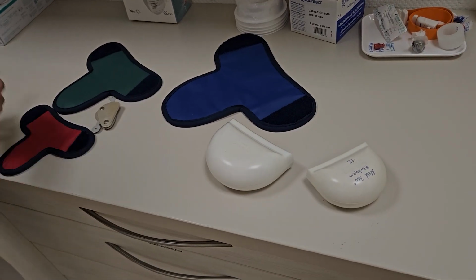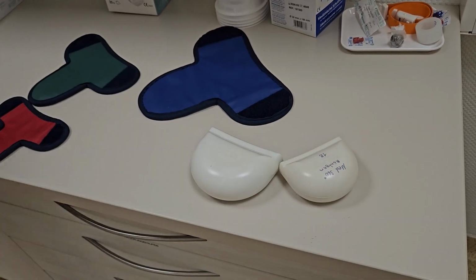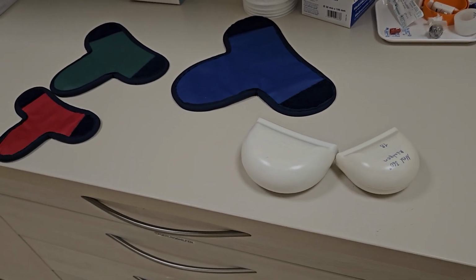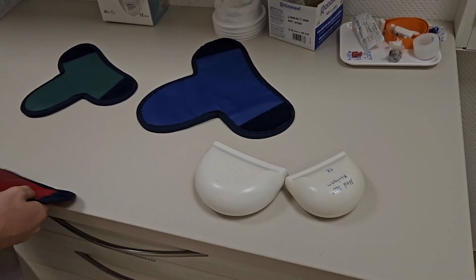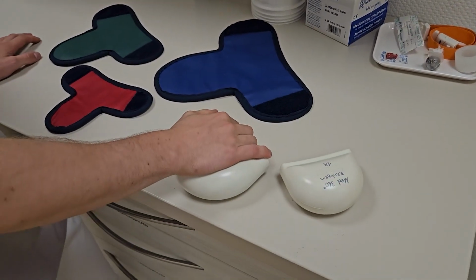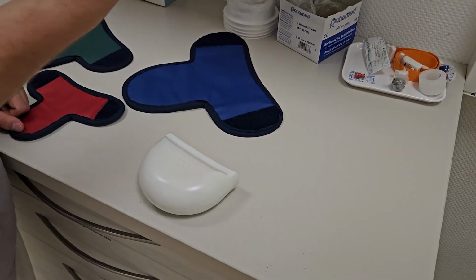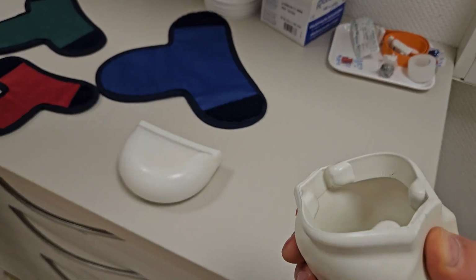Of course, giving the patient lead shielding, depending on which parts of the body need to be photographed and which important parts are in direct vicinity. Just normal shielding would be boring, but we have testicular capsules. The penis should not go in there. It normally shouldn't even fit in there. A disposable film goes in there for protection, don't worry.